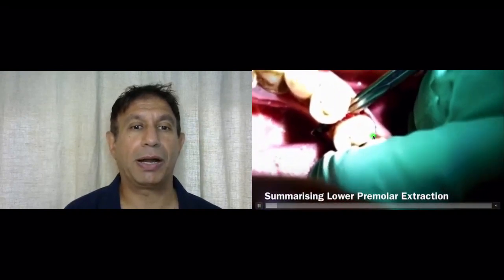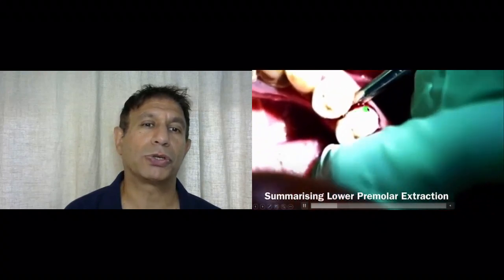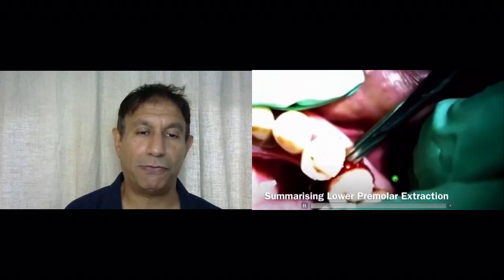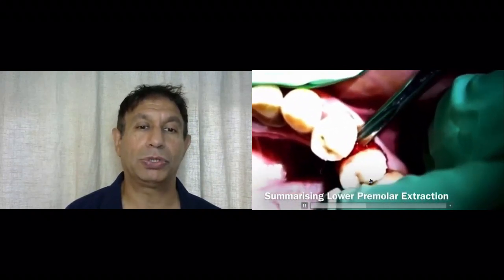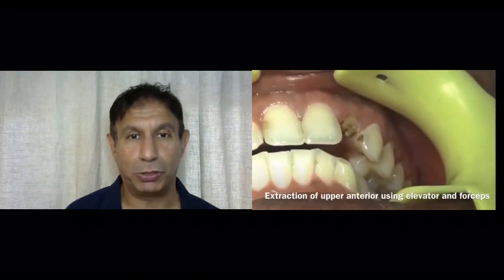When we see that done in real life, we are putting our elevator here and the elevator goes in the front part of the tooth, concave side facing the tooth. Turn it by a quarter turn, pushing the hard tooth against the soft bone, expanding the socket around the tooth. So it's loosening the tooth up. Remember, the elevator is in constant contact with the tooth. It is not jammed between the two teeth. It is jammed between the tooth and the bone, with the elevator in constant contact with the tooth. And then you hold your forceps, grip it as low down as possible, outside-inside rotary movement, and out pops the tooth.